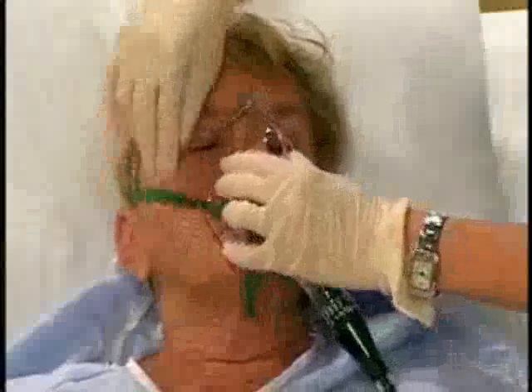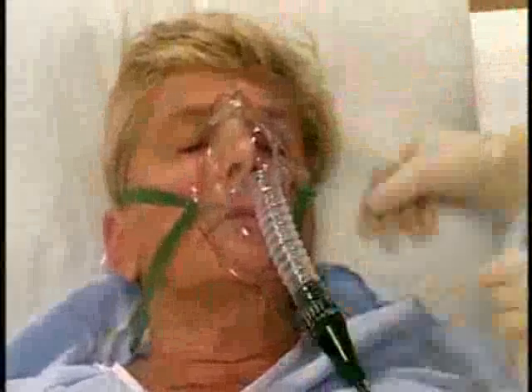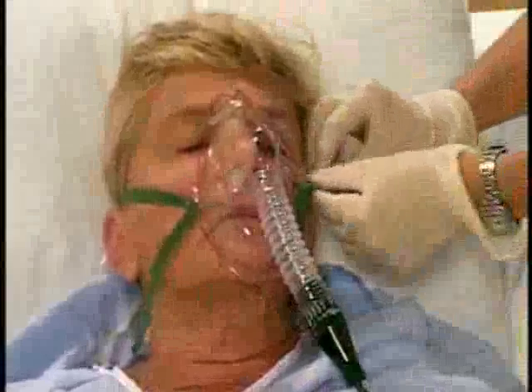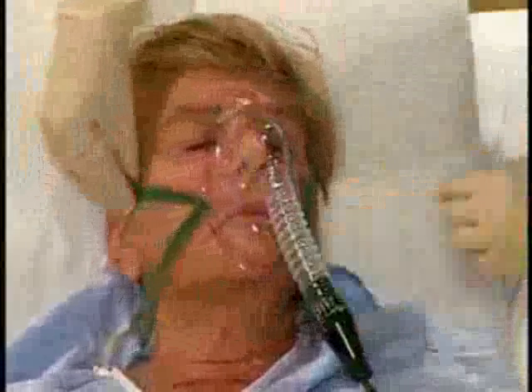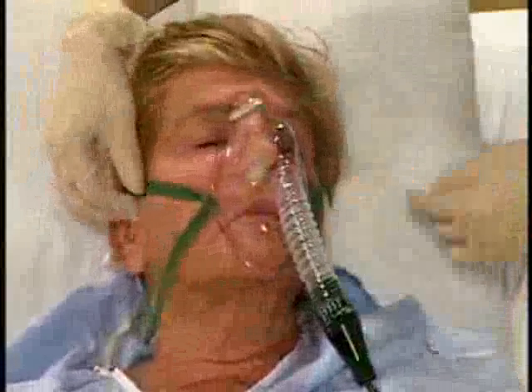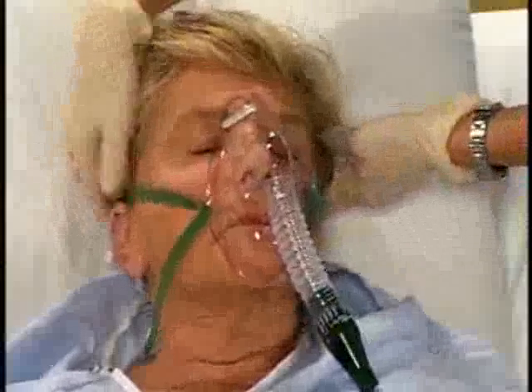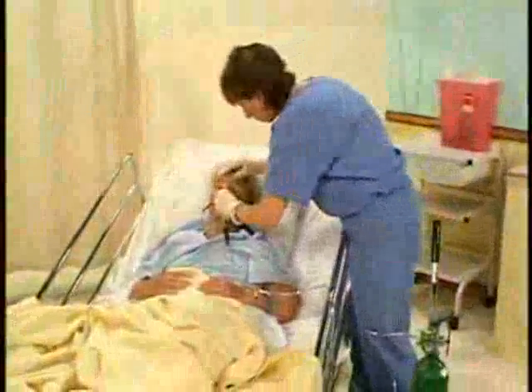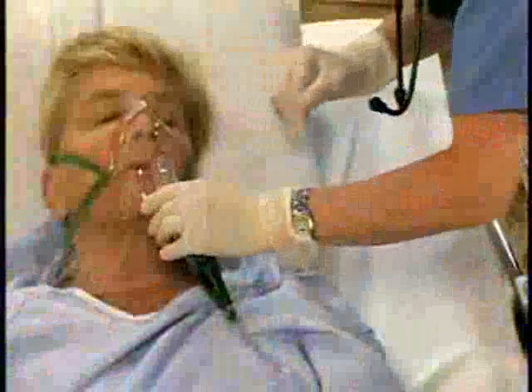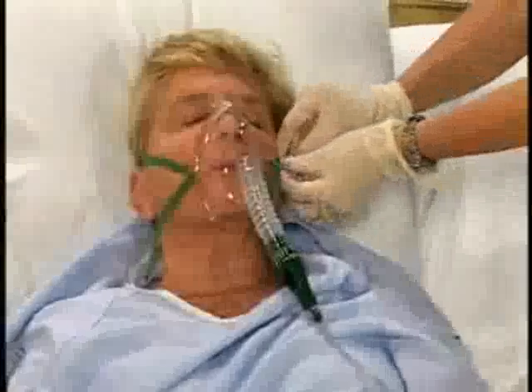Check for the proper flow rate every four hours. Ensure that the ports of the high-flow device are not under the covers or impeded by any other source, to ensure the proper oxygen percentage is being administered. Assess the client's face and ears for pressure from the mask and use padding as needed.